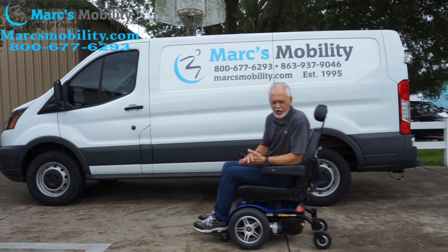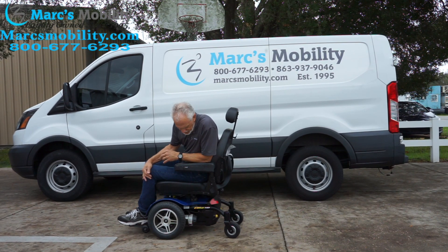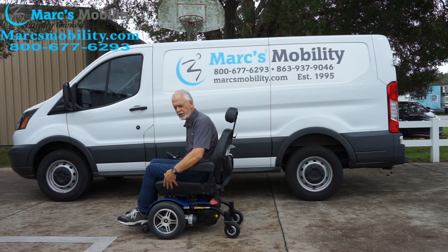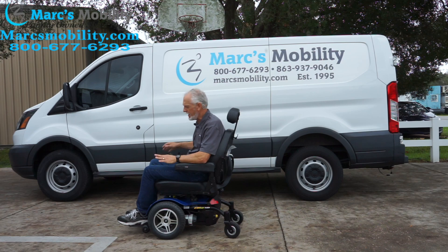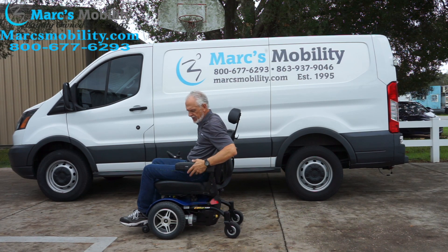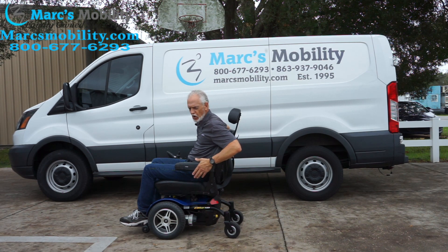It went through the grass pretty well because it's front wheel drive. This is the Jazzy Elite HD — 450 pound weight capability, 21 by 21 captain's seat, flip up arms, flip up foot plate, swing away joystick — just a nice power chair. If you need an HD chair but don't want something super large, this chair is only about 25 to 26 inches wide from arm to arm.